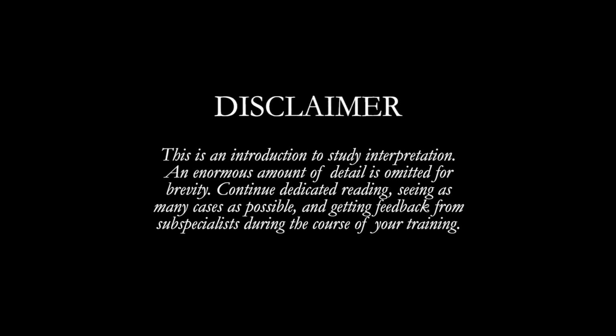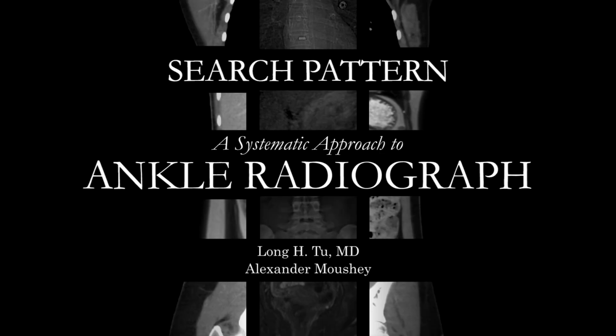Please note that this is an introduction to study interpretation. An enormous amount of detail is omitted for brevity. Continue dedicated reading, seeing as many cases as possible, and keep getting feedback from subspecialists during the course of your training. All right, so today we're going to talk about a basic approach to the ankle radiograph.